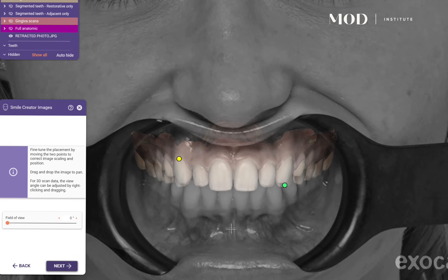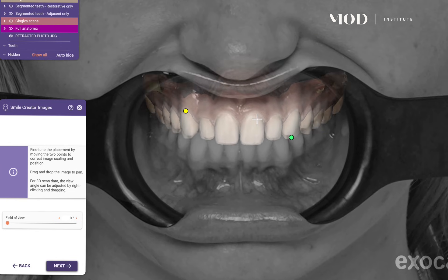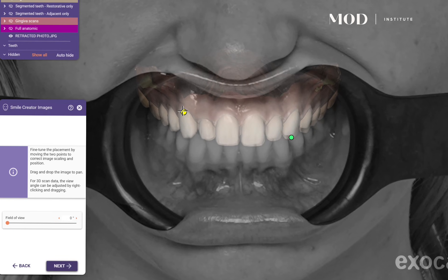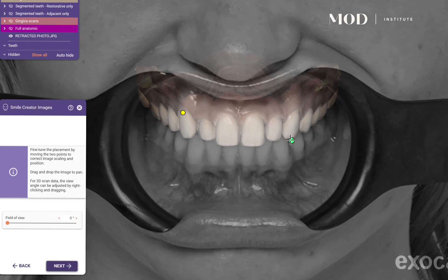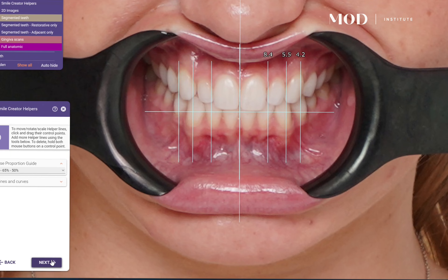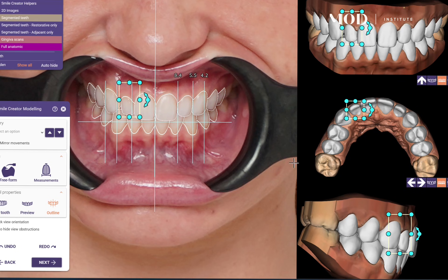I need to get an ideal alignment of the two separate and distinct images — first we have a retracted photo and the intraoral scan. I'm using manipulation of control points to basically align a three-dimensional model to a two-dimensional photo, then bringing this into the tool that lets me put my proportion gauge on here — I'm using a 165/50 proportion gauge.